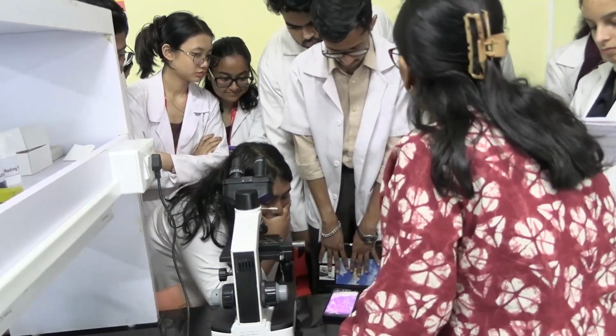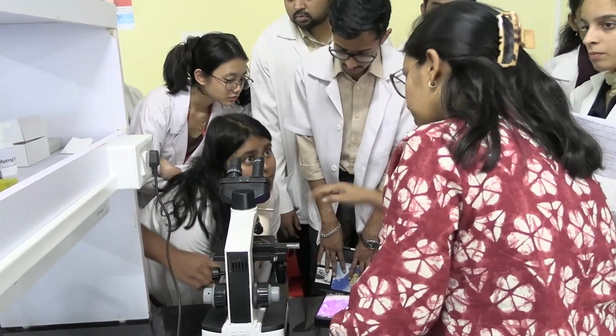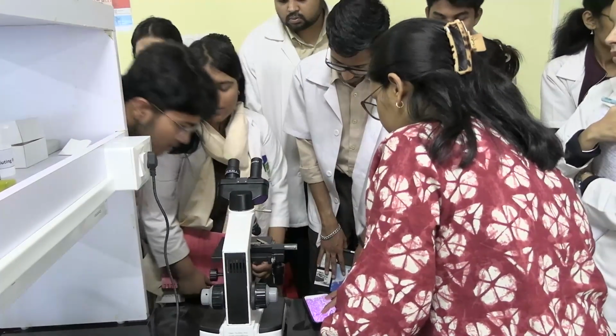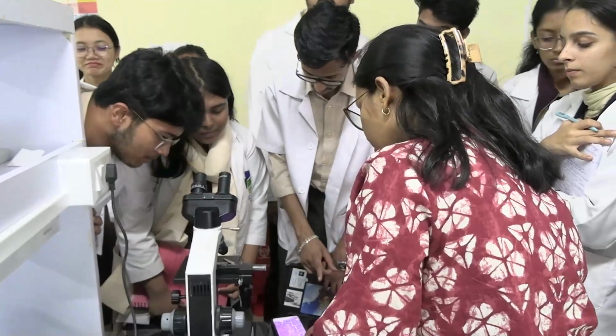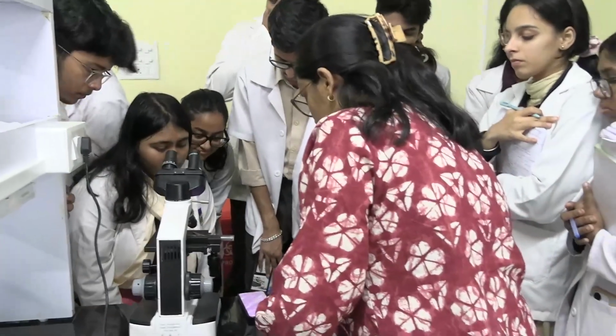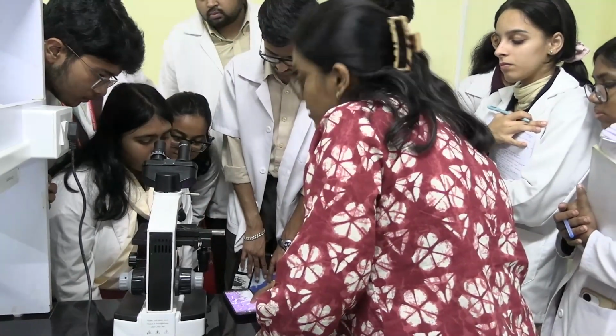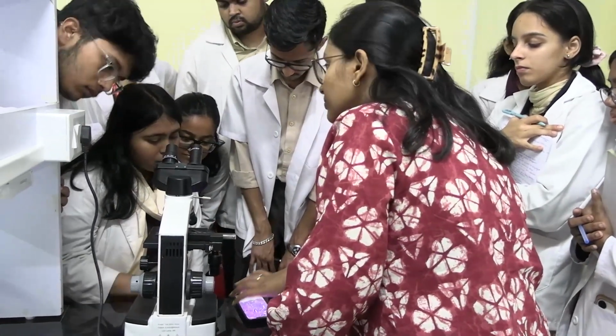Ma'am, I can't appreciate the bluish nucleus. You can't appreciate the bluish nucleus? Come this side. Now can you appreciate? Here can you see? Yes, ma'am. Okay. In comparison to this, can you see the normal glands? Yeah? Okay. Yes, ma'am.